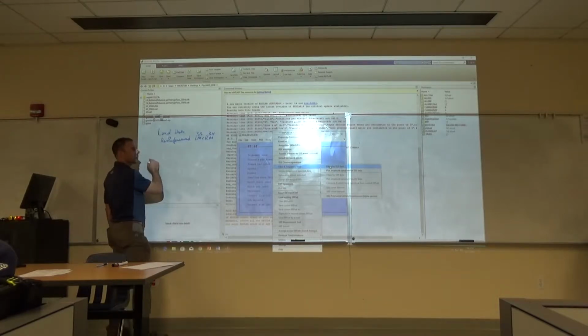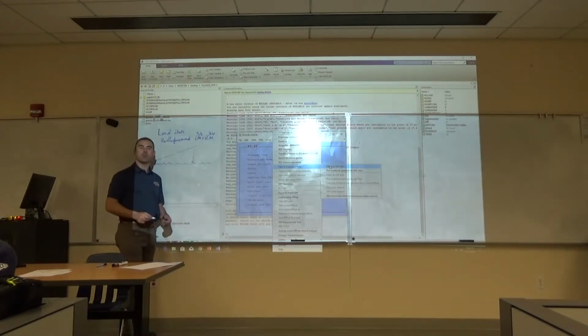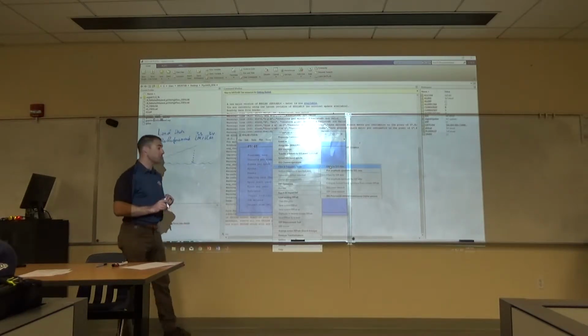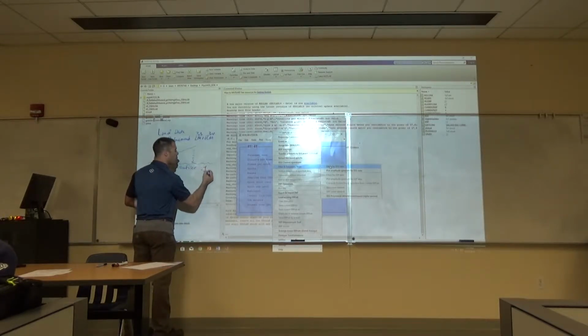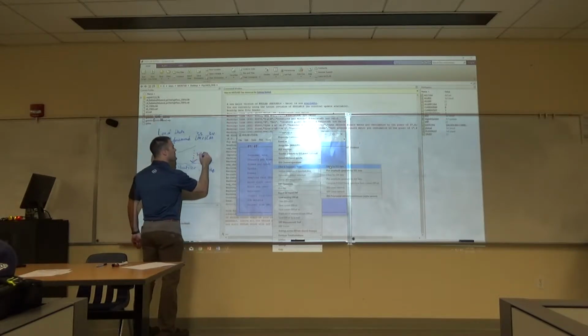So the next thing that we want to do is basically that linear detrend, because we have that long pattern in the data that we want to bring down to read kind of normally. We're going to do that by virtue of what kind of filter that we talked about in class? You guys remember? High pass filter? It is a high pass filter, exactly. So we're going to do a high pass filter at a value of 0.1 hertz. That's going to do the function of a linear detrend of the data.